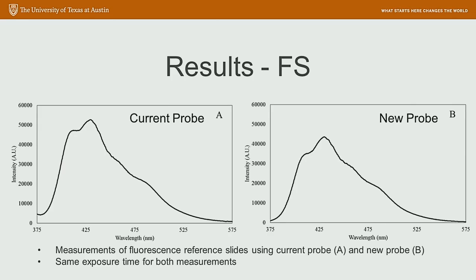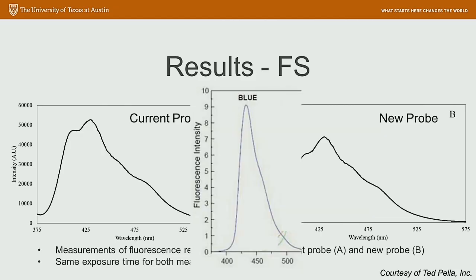To characterize the fluorescence spectroscopy, we took measurements on a fluorescence reference slide using both probes. With similar exposure times for both measurements, you can see that the collected fluorescence spectra are in general agreement, and also in general agreement with what the published or the manufacturer fluorescence spectra should look like.